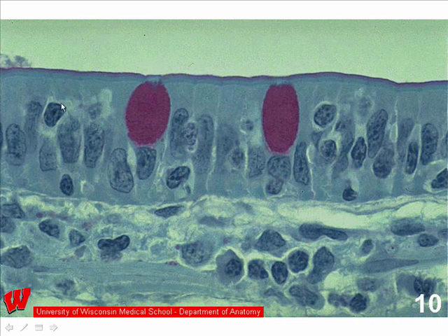And you'll note that these cells do not touch the apex and they do not touch the base. So indeed they are not epithelial cells because they don't fit the definition, but they happen to be present within the epithelium, that is in between the epithelial cells, because these cells are looking for breaks which occur or could occur between these epithelial cells, permitting the contents of the lumen of the gut to pass this barrier and get into the blood in the connective tissue beneath. And that's something that needs to be avoided.